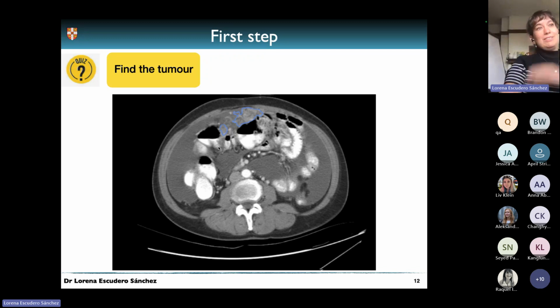So we need to go towards AI and deep learning based tools to identify this automatically, because the processing based algorithms that we could use have limited applicability or will have limited accuracy or success in finding things like this, because there's no very clear pattern. It's very difficult to be able to do something like this just with processing tools. So with this type of very complex tumors, we need to go to a data-driven approach.